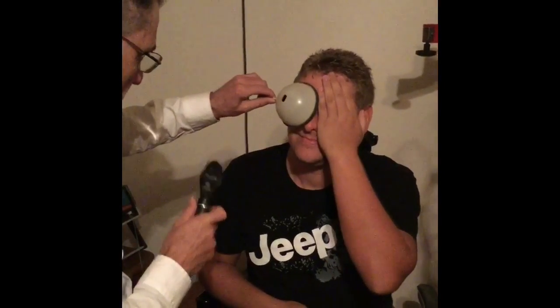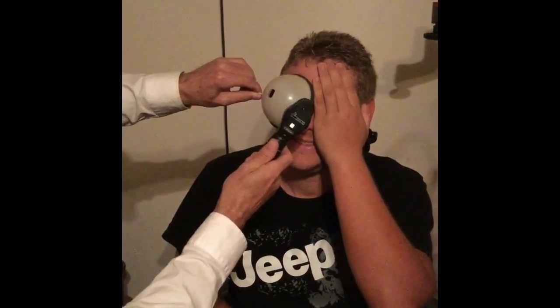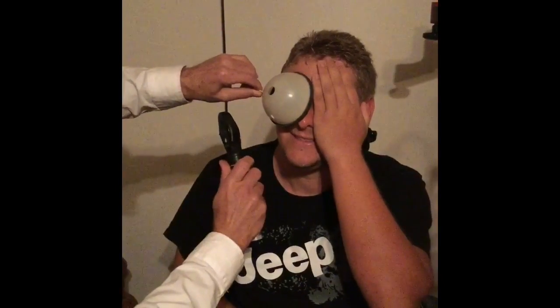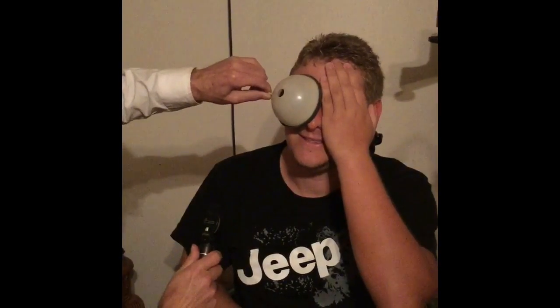I'll now demonstrate it on a real live patient. Hello Mr. Fik, can you cover your left eye with your left hand? Now I want you to look at me with your right eye. Can you see me? Yes. Can you see the light here? Yes. Can you see the light here? Yes. Where's the light now — left or right? Left. Now right. Now bottom or top? Bottom. Now left, can you see it? Now right, can you see it? No.